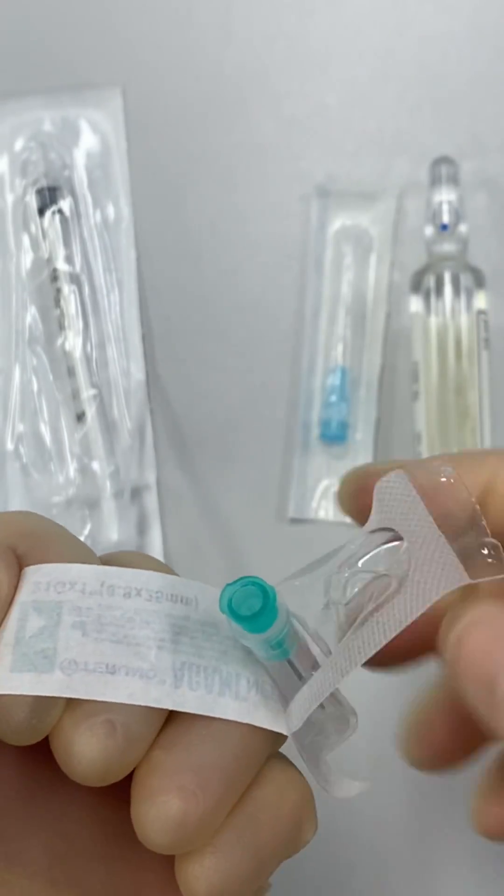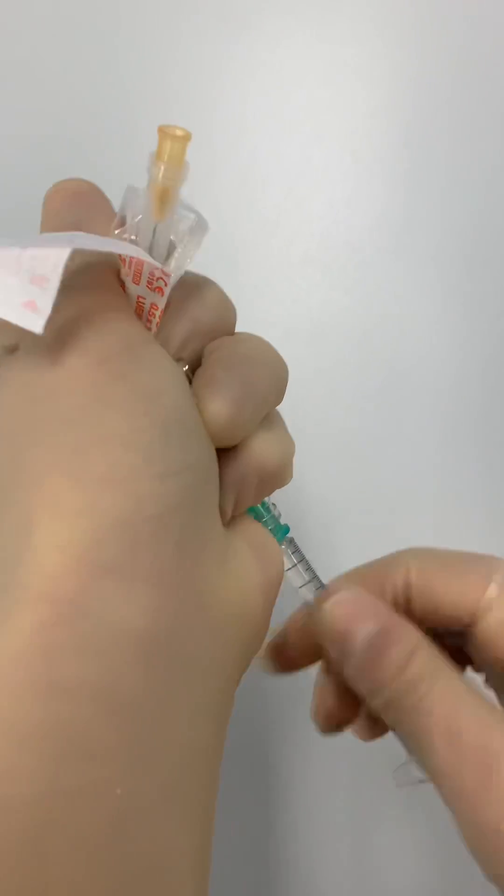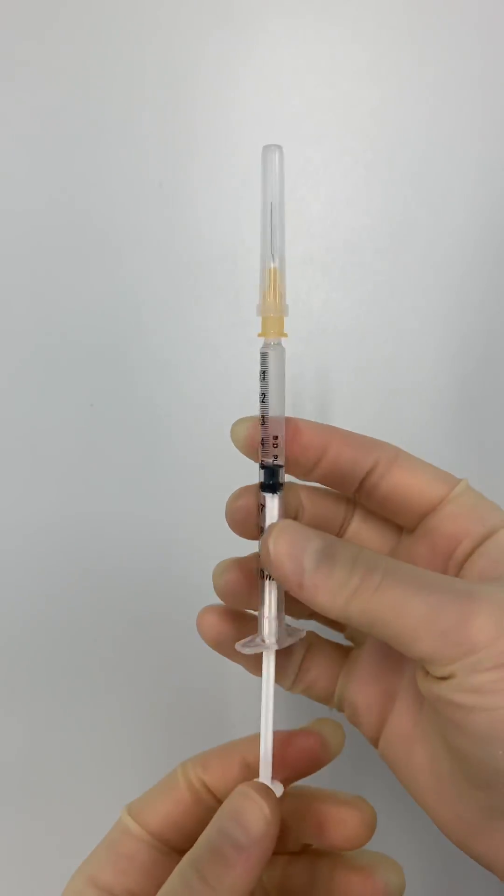And yes, to make things more confusing, smaller gauge needles have a bigger diameter. So an 18 gauge needle can be used to draw up medications, while a 25 gauge needle can be used to inject them.